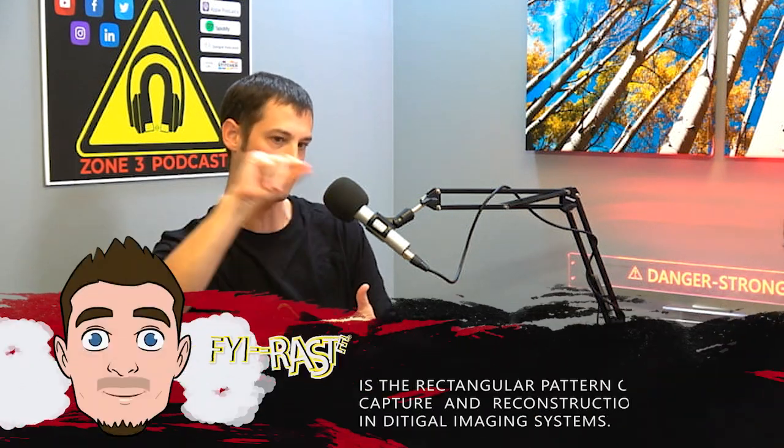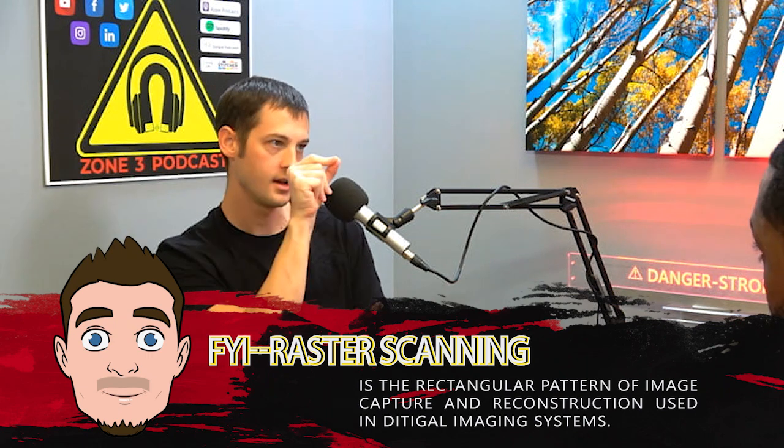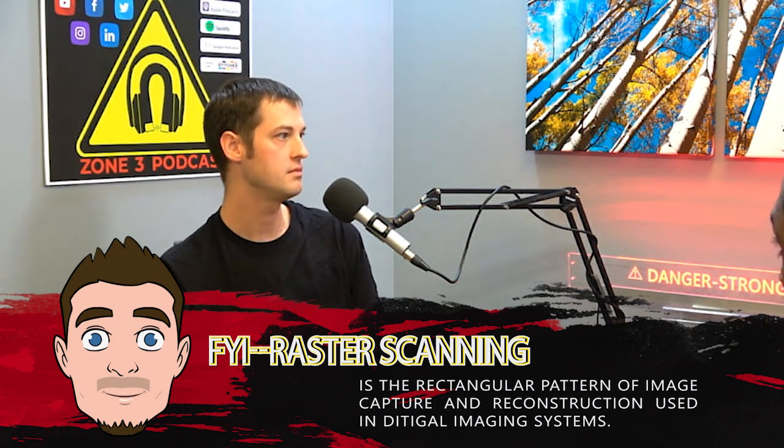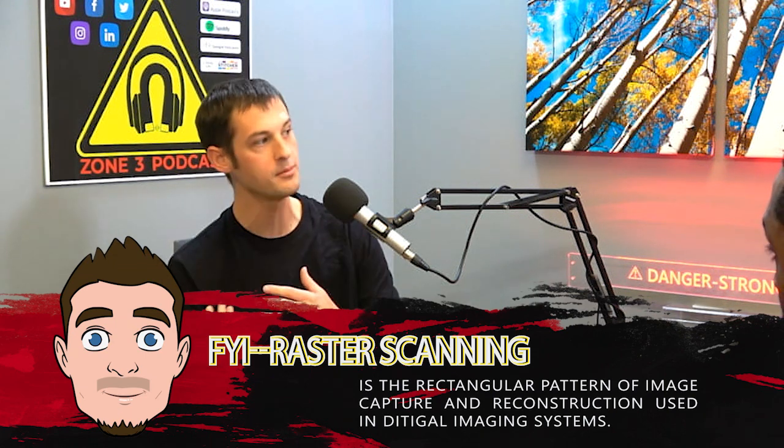So think of pixels like 256 square, and it's like scanning through with this magnetism thing, but it's not coming out as an image, it's coming out as Kspace. Like it's not an image. After you do that acquisition, you have Kspace information.